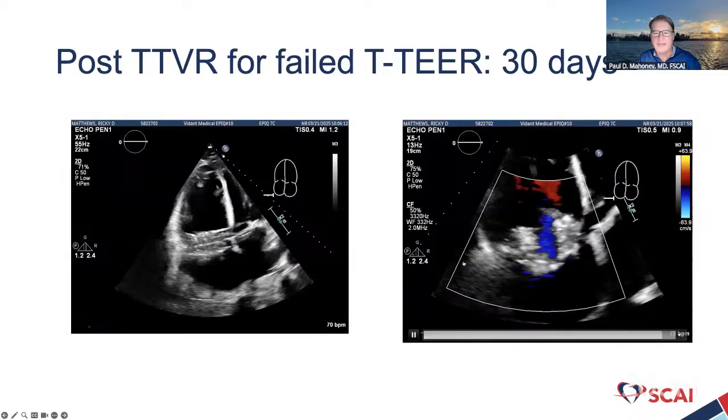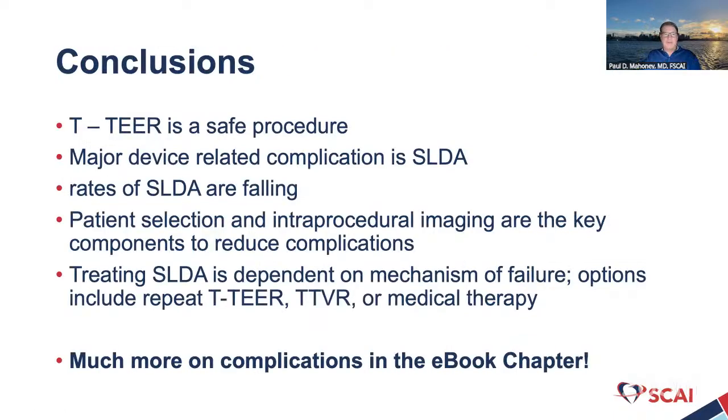So in conclusion, TEER is a safe procedure. The mortality rates are exceedingly low. The stroke rates are exceedingly low. The major device-related complication is SLDA. The rates of SLDA are falling over time. Patient selection and intraprocedural imaging are the key components to reduce complications.